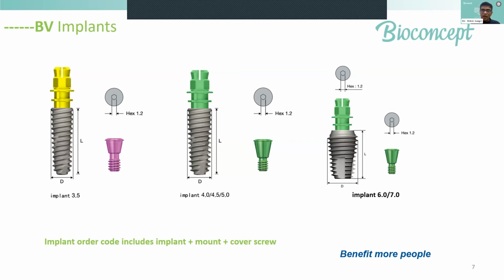And lastly, we have the wide implants, which are the 6 and 7 mm diameters. They can be used in posterior areas where we have low RBH, that is residual bone height, and we want to still use an implant for stabilizing your prosthesis at the distal end. These are what we call the ultra short wide implants. Short because we will use them as 6 mm by 6 mm in length or 7 mm max. You don't want to drill a 13 mm, 6 diameter implant.